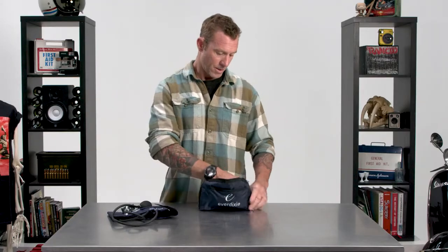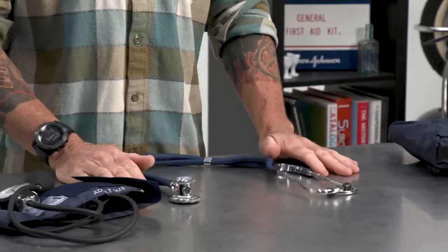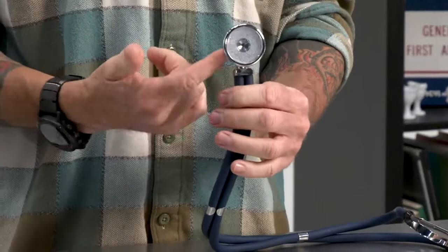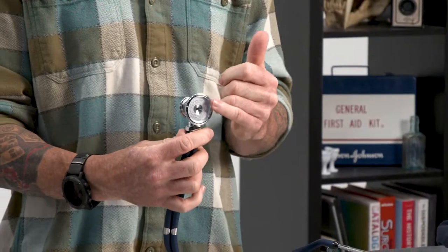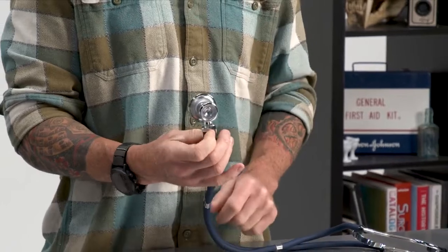Moving on to the stethoscope — pretty simple piece of equipment, but very usable and very handy. You can do so many diagnostic things with this. This part, which is called the bell, this one happens to be double-sided. You're going to be using the large side more often than not, and it does have a smaller side as well.